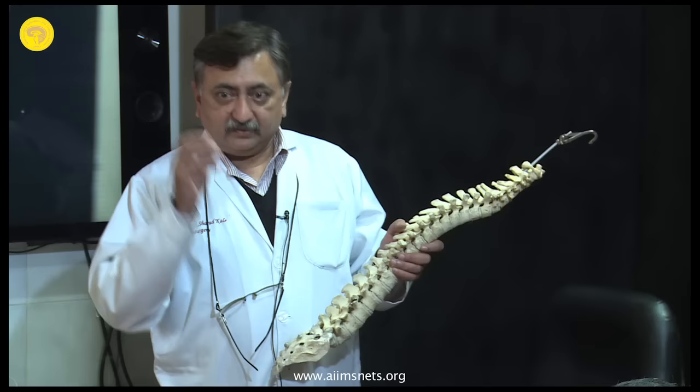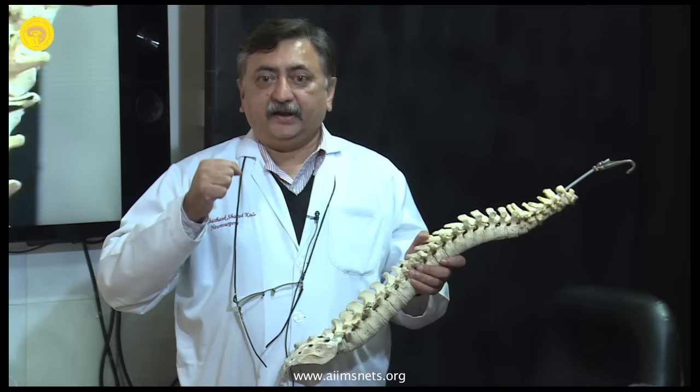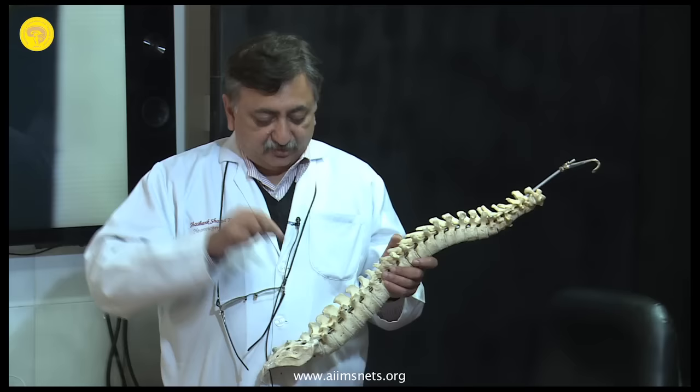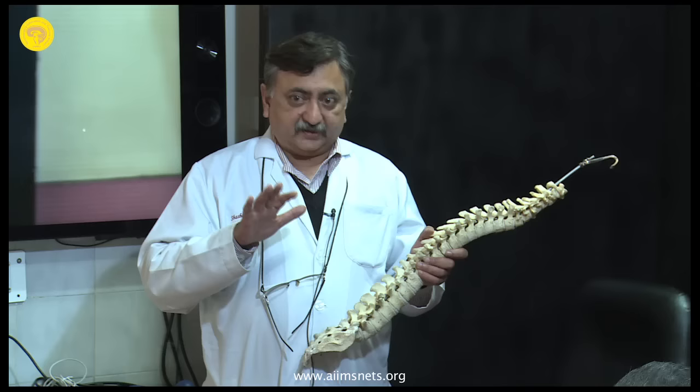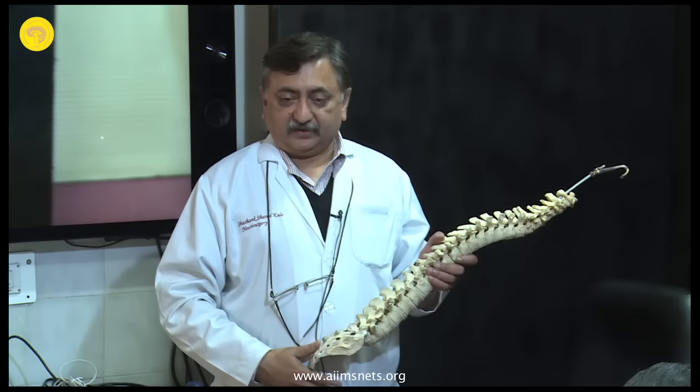First thing is to use the awl, A-W-L, awl. It's got a sharp triangular point. It is used to break the outer cortex. You break the cortex with the awl. You have to, otherwise you can't do it. You see that the direction of your awl is generally in the direction where you want the screw to be. That is the medial, etc., etc. All the angulations, everything you've taken care of.